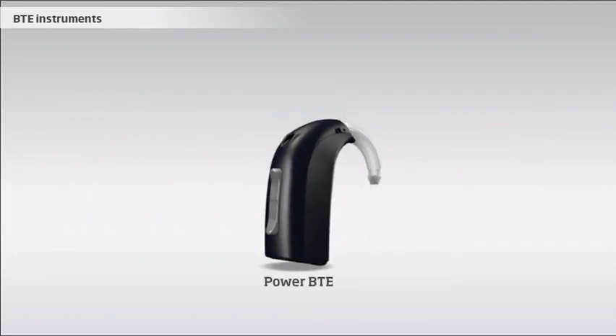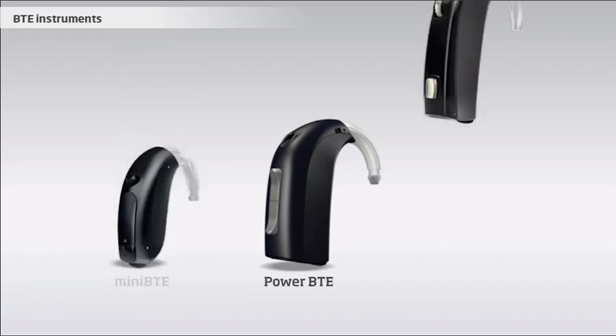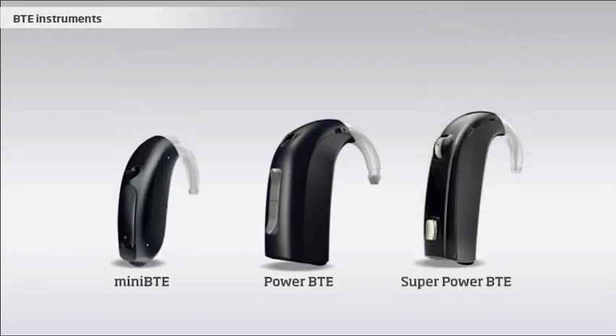The BTE instruments are available in different sizes. As a rule of thumb, the larger versions can provide more power and cover more severe hearing losses. Additionally, the bigger BTEs have space for more functions, such as a push button for controlling volume and settings.